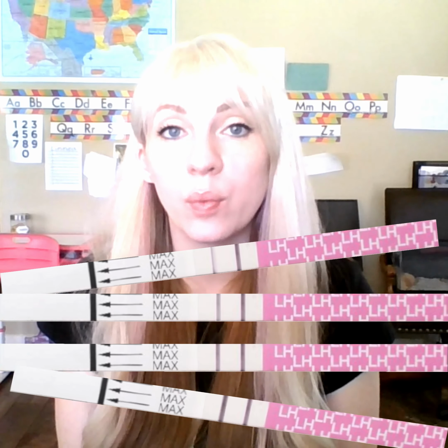Let's talk about how to read your ovulation strip. Keep in mind you will always have two lines whether you are ovulating or not. It is how dark the line is that tells you when you are having a surge. The side that is predicting your LH hormone will be light when you are not ovulating or at the beginning of ovulation. The closer you get to your surge, the darker in color it will get in comparison to the other line. The best way to monitor and keep track of this is with an app.